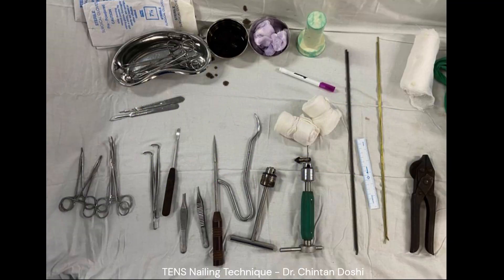Instruments required are: appropriate size TENS nails, curved and straight, two T-handles, plier and hammer, Harrington rod cutter, F-tool, and general orthopedic instruments.